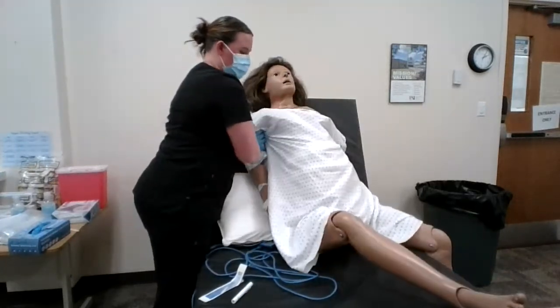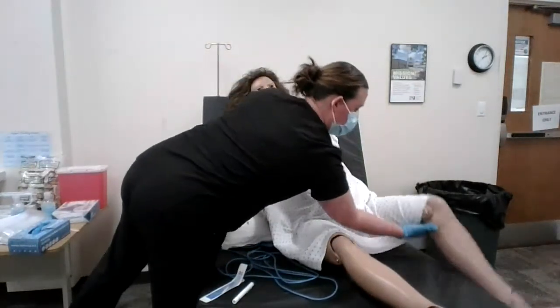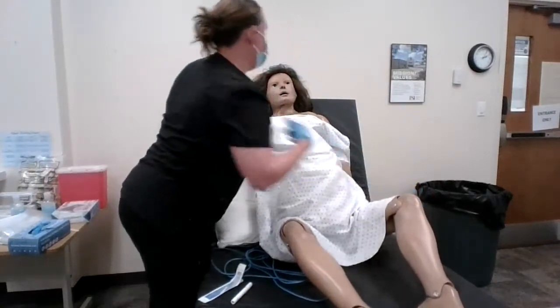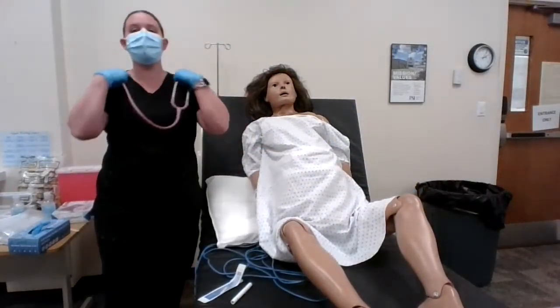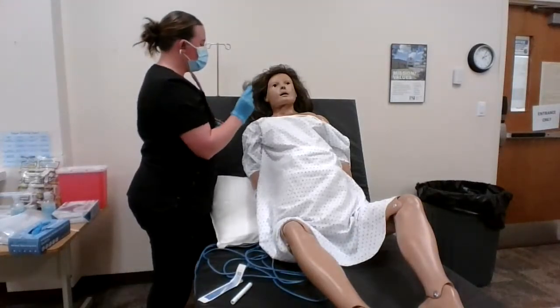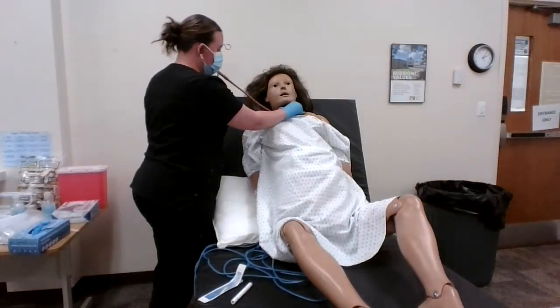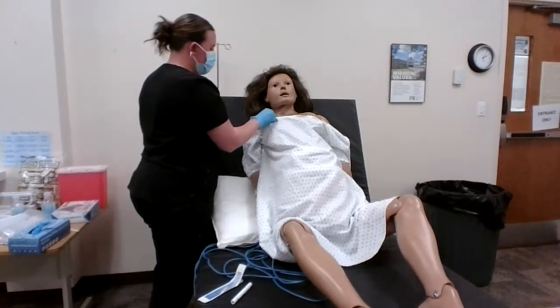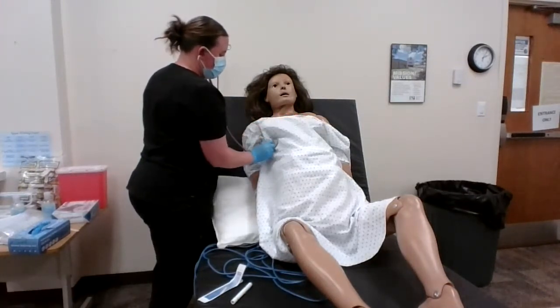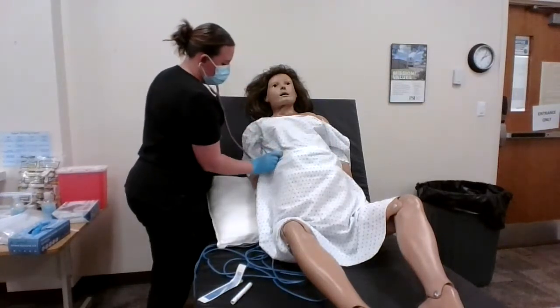Now you will auscultate and listen to those lung sounds. Auscultate the anterior lung sounds, making sure to hit all 10 sites. Okay, so when you're hitting your 10 sites, the first 2 sites are above the clavicle. Every time I put my stethoscope on your chest, can you take a deep breath for me? 1, 2, 3, 4, 5, 6, 7, 8, 9, 10.